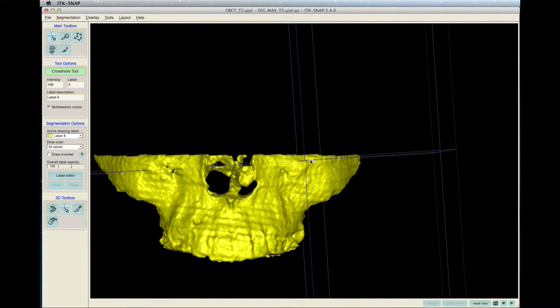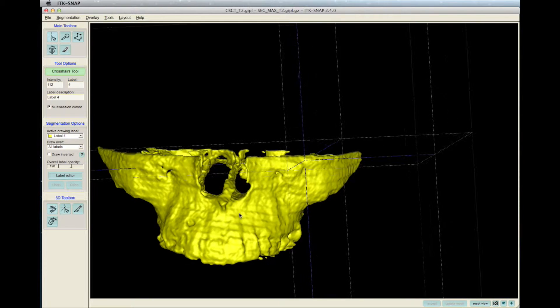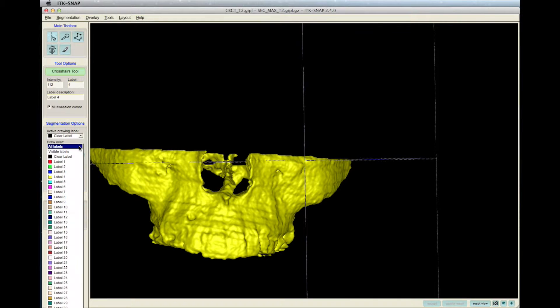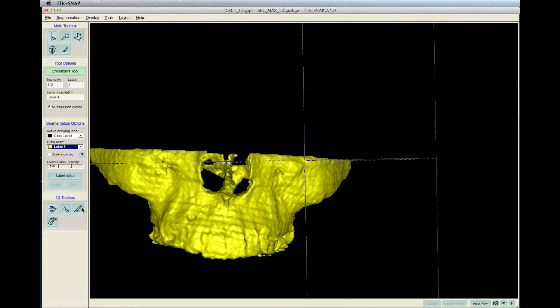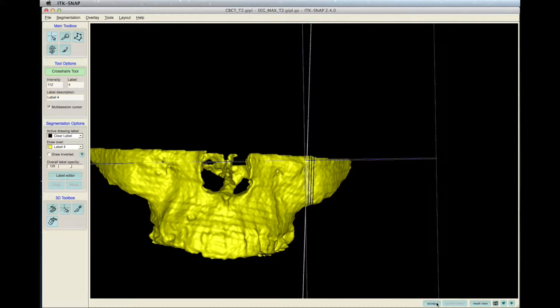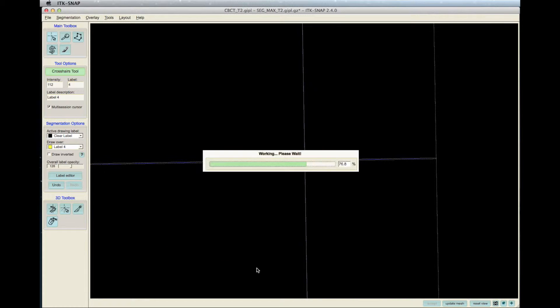Align the maxilla so you have a good view. For Active Drawing Label, select Clear Label. And for Draw Over, select the maxilla's color — in this case, yellow. Select the scalpel icon, then click an initial point, then a second point to create the slice and set the plane. To apply the plane, click Accept, then click Update Mesh to see the modifications applied.